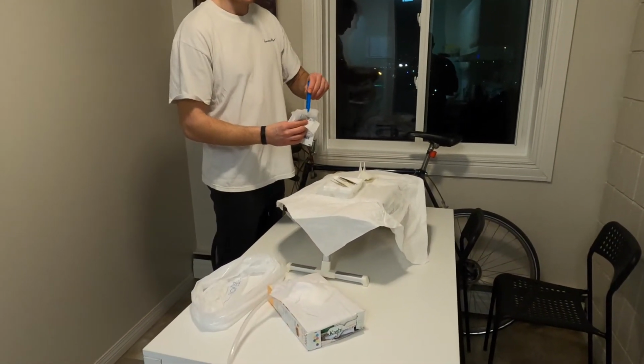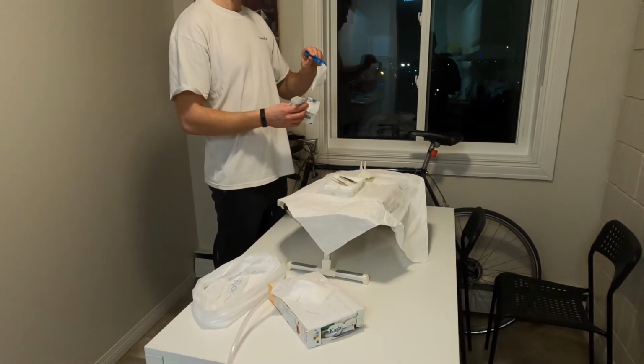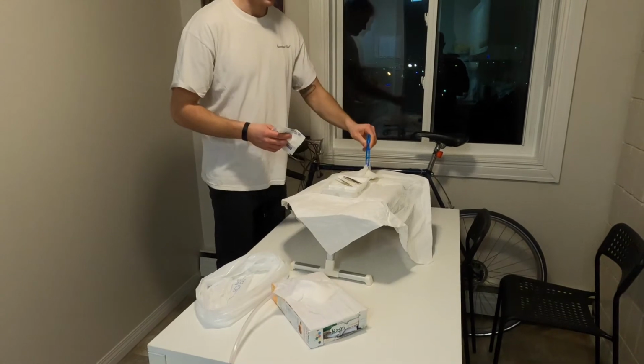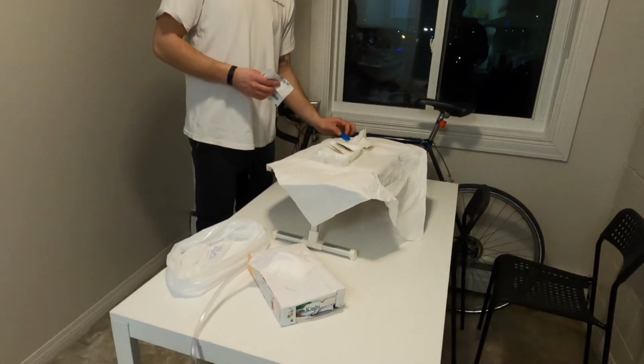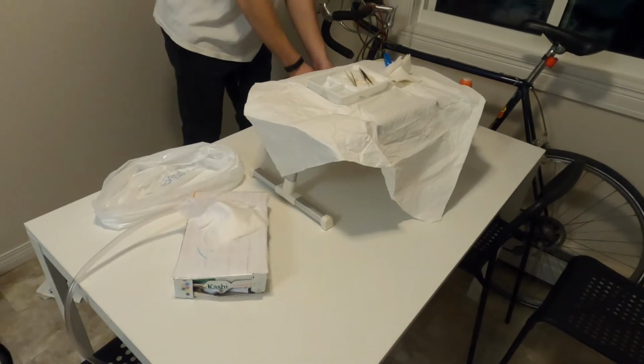But I'm going to continue here. And again, same thing with the gauze. Just the gauze there, perfect. So put this here. And lastly, Gelinet.